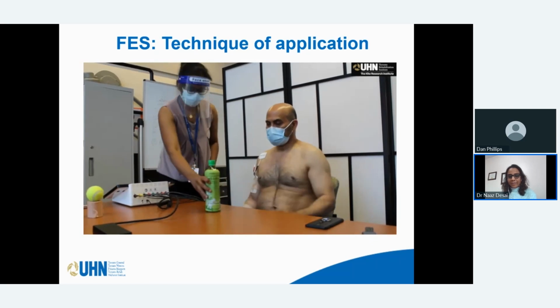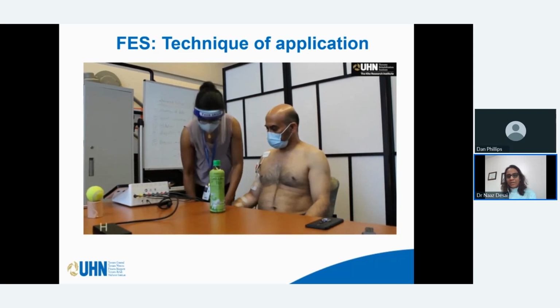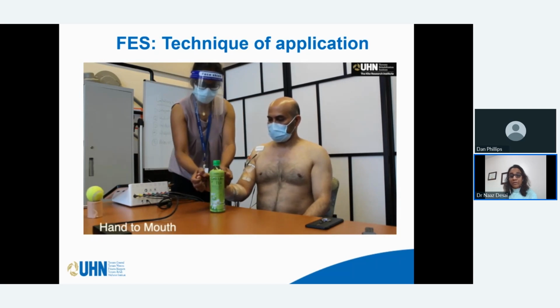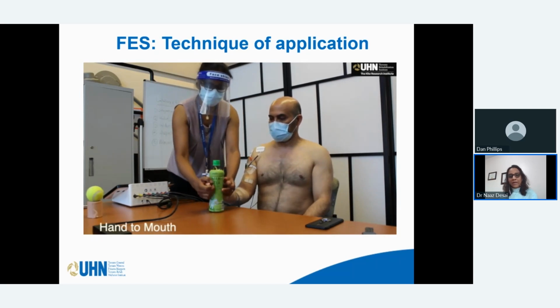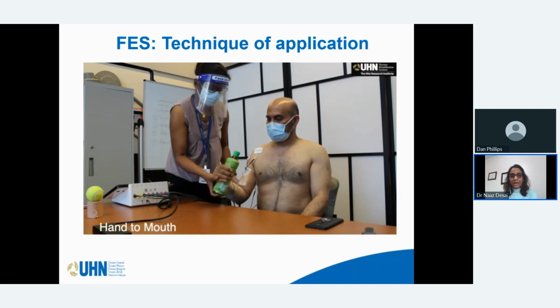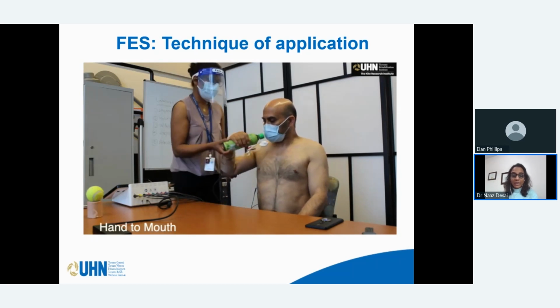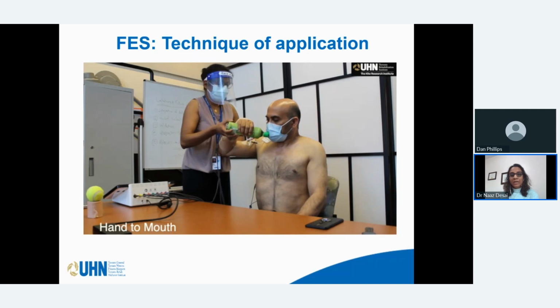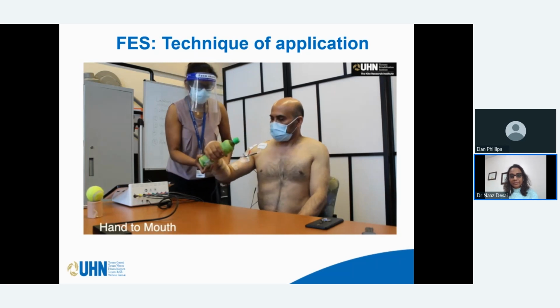This is another example. We use a lot of day-to-day objects when we are doing training with FES. Sometimes we ask patients to bring their own objects in, and it's very goal-oriented. Patients do tell us what are the kind of activities that they'd like to get trained on. So we try and do our best to see if we can actually help them regain function around their goal setting.